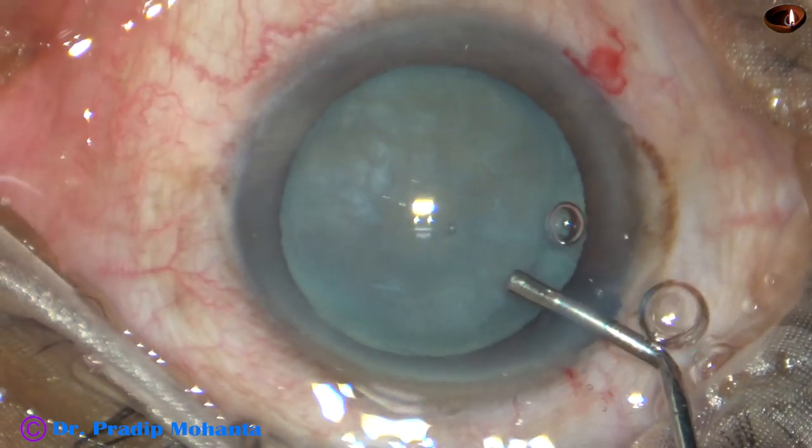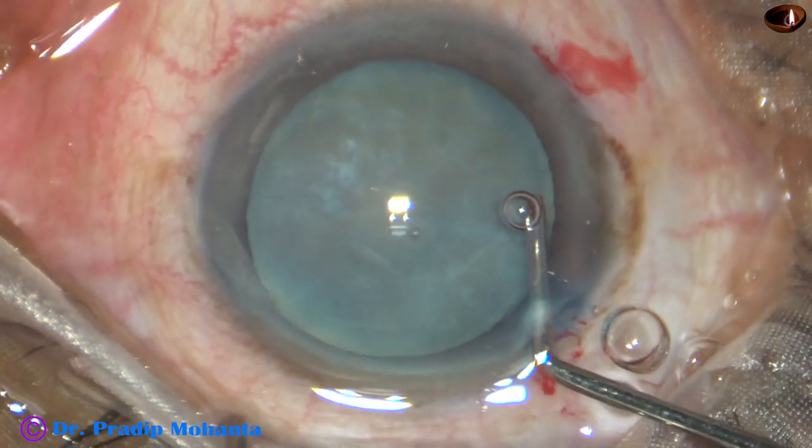And now 2% hydroxypropyl methylcellulose is used to fill the anterior chamber. And now capsulorhexis is to be done.